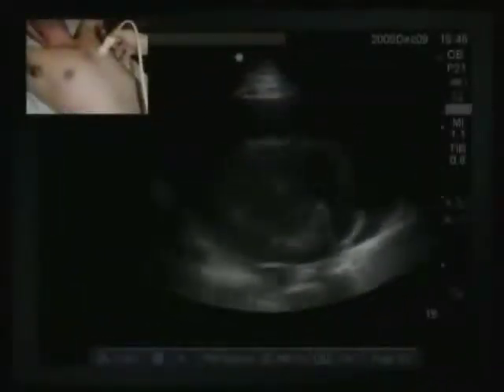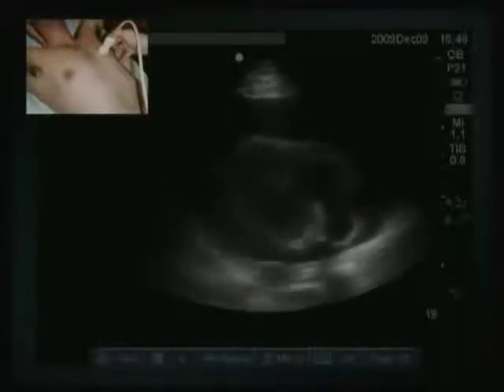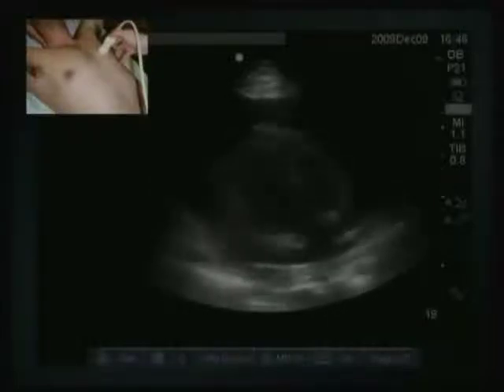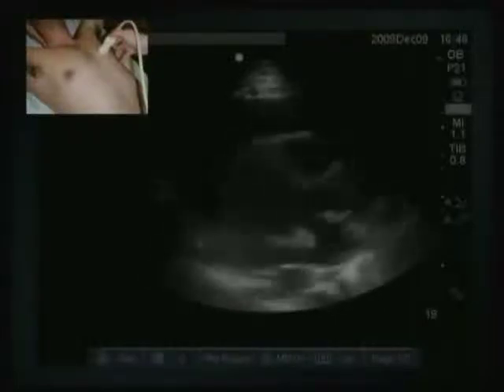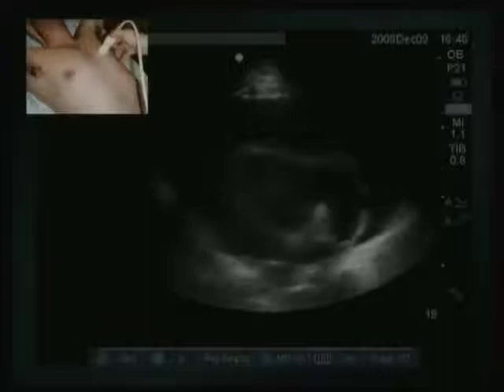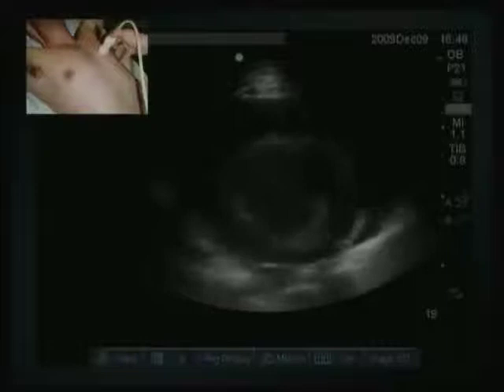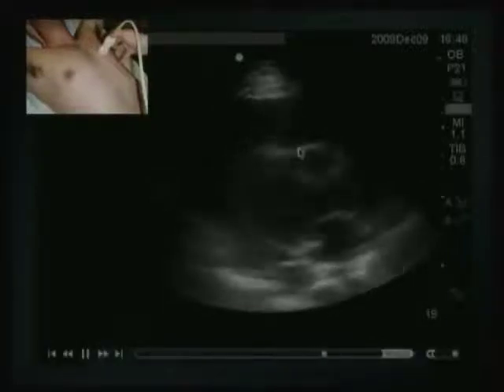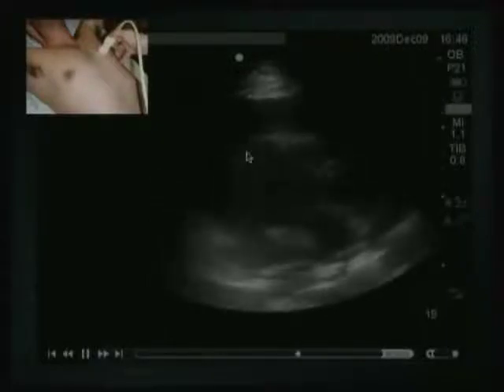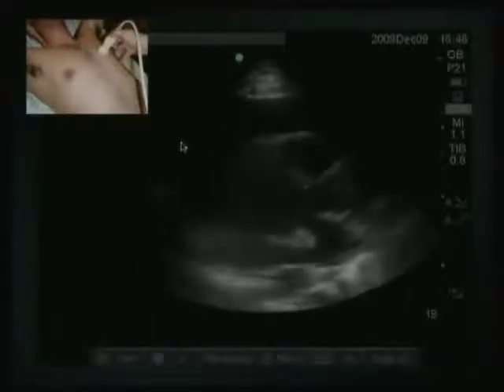When you look at a parasternal view, it's a little bit easier to visualize the free wall of the RV. Again, in this example, there's a lot of movement of the heart, but what you're looking for is impaired relaxation during diastole of the RV. So typically, the RV would relax symmetrically. Whenever there is increased pericardial pressure, it often causes a little bit of a serpiginous shape to the RV free wall, or like a little bit of scalloping kind of pattern. And so when you see that, that's often a tip-off to cardiac tamponade.